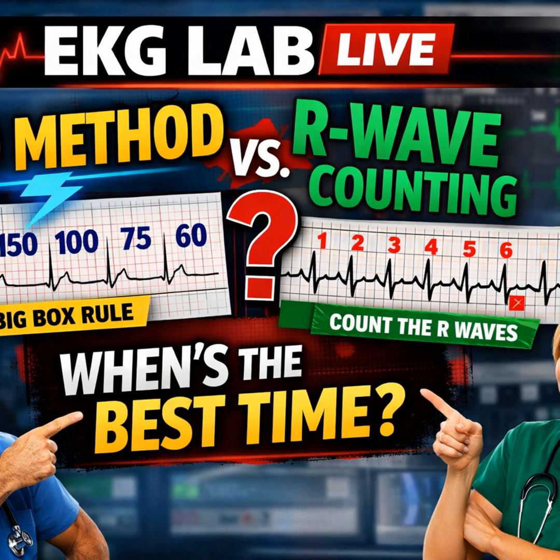Let's talk about ventricular tachycardia. The UNC source defines it: greater than 30 seconds of wide QRS with a regular rhythm. Fast and wide. But regular, that's the key. If you have a patient who is unstable but still has a pulse, a crash scenario but not yet a full arrest, you have to decide, is this VTach or is this just sinus tachycardia with a bundle branch block? And that can be a nightmare to tell apart? Right. If you use the strip method, both just look like fast, wide spikes.